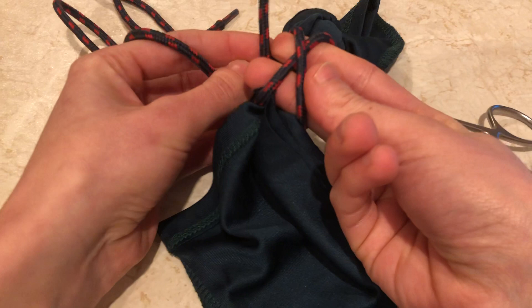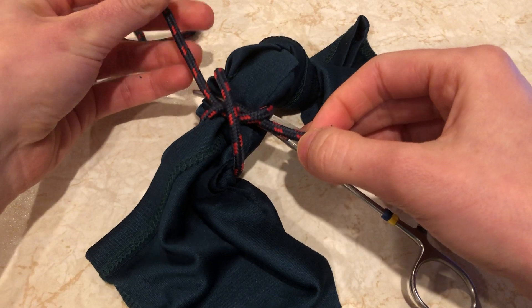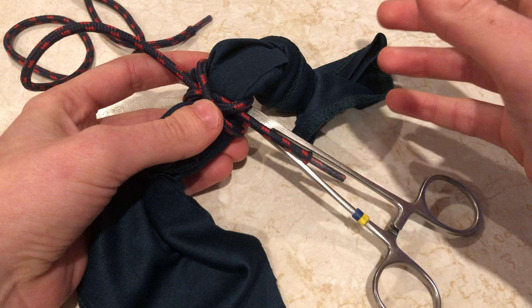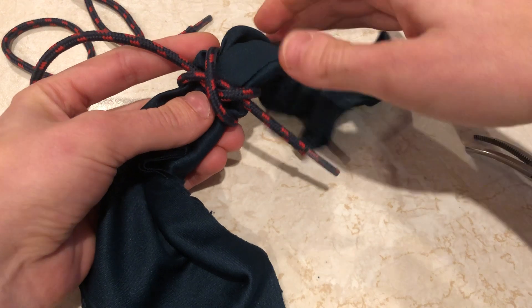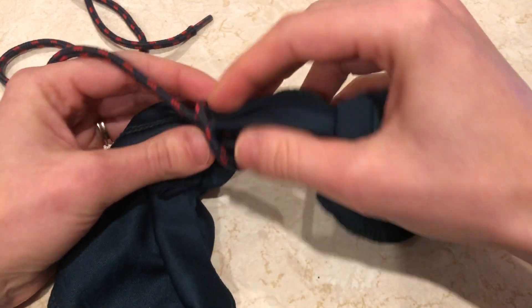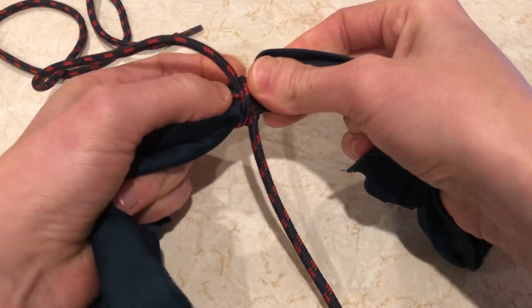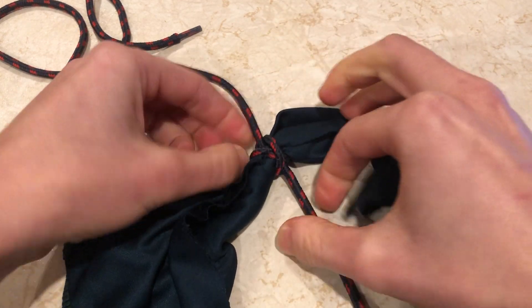With those needle holders we're going to grab that trailing edge and pull it through — and that's your constrictor knot. Now before you start tightening this, because it is a self-tightening knot, you definitely don't want to tighten anything before you've checked that you don't have any unwanted tissue within those throws. So at this point I tend to remove the clamp and just check. Pull those encircling loops closer together, check there's no fat or any tissue anywhere near, and once I'm happy I will simply constrict. You can see how comfortably and effectively that constricts — it's almost impossible to loosen now, it's really tight.